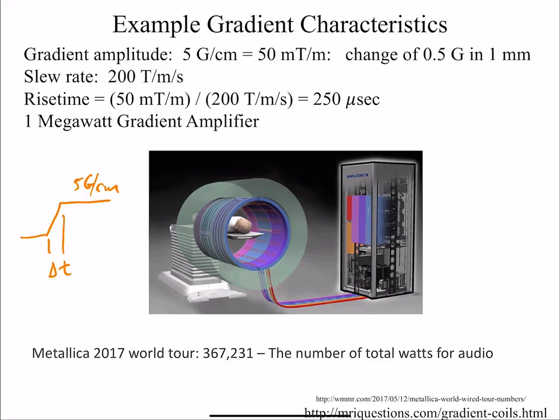All right, so what you're hearing is essentially the gradients have these time-varying currents running through the coils. So you have a current in the presence of a large field, right? The main field, like the 3 Tesla or the 7 Tesla field. So what's going to happen to that current in the presence of the main field? What force is it going to experience from physics? Anyone?